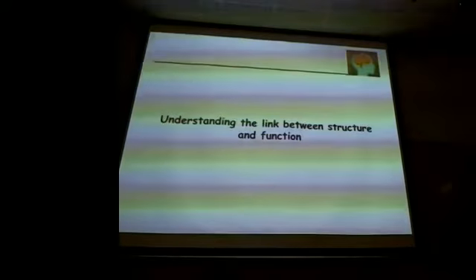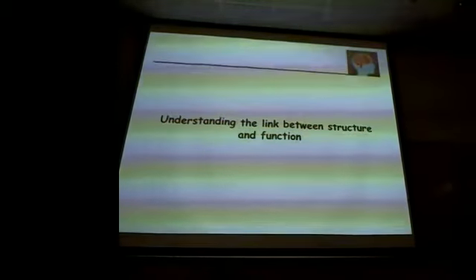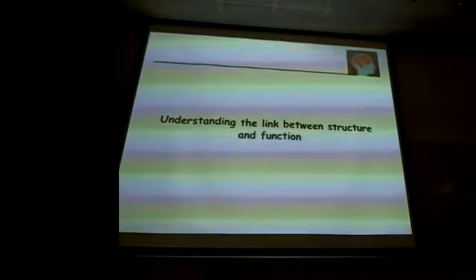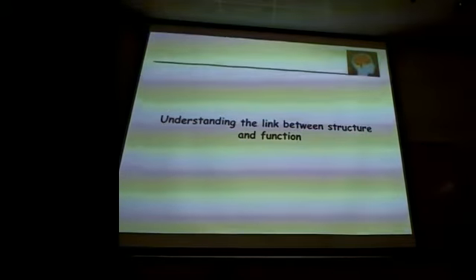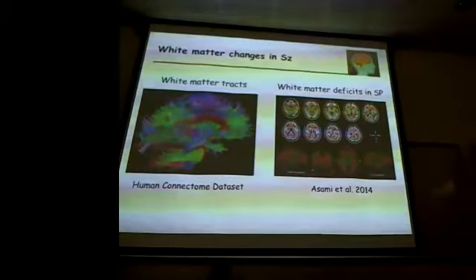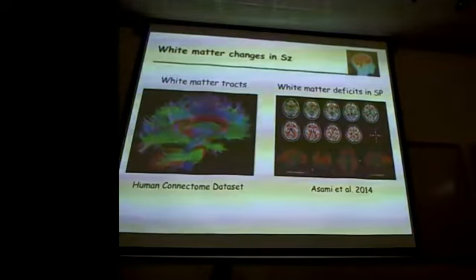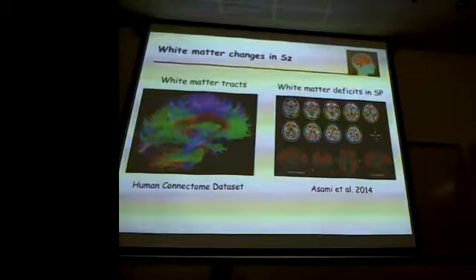So I'm going to jump now to some of the work we've done in terms of linking MEG with other measures. So one of the studies that I did more recently was really putting MEG and DTI data together. This was using the Joint ICA toolbox.